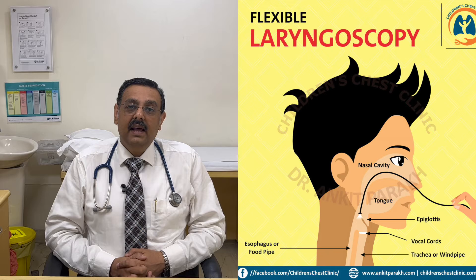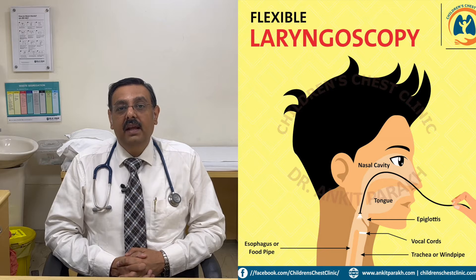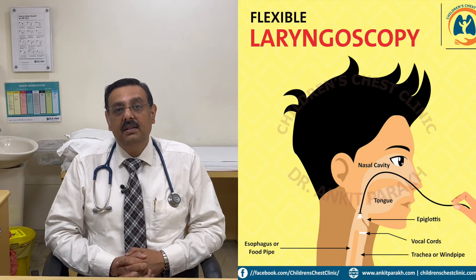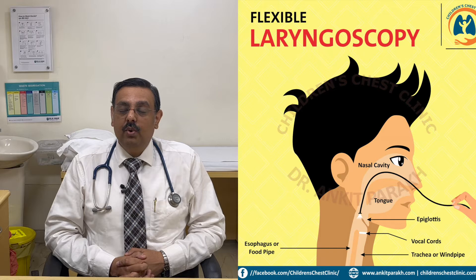The laryngoscope is then advanced further where we reach the voice box, the larynx, and here we evaluate the voice box which includes the epiglottis and the other cartilages. We also look at the movement and the symmetry of the vocal cords.